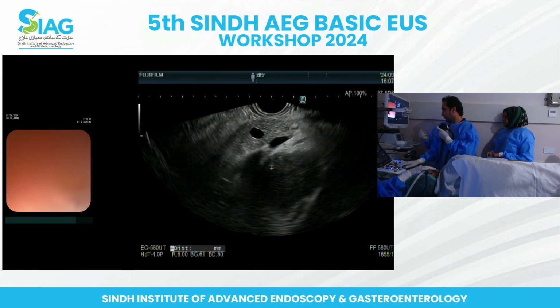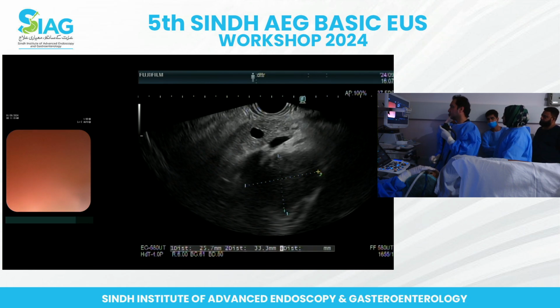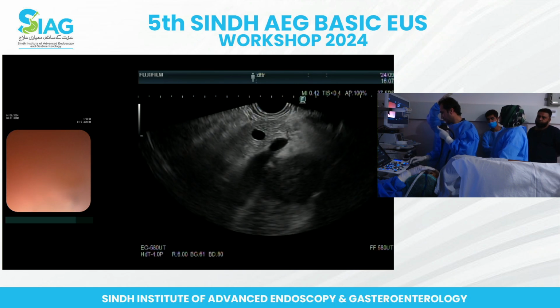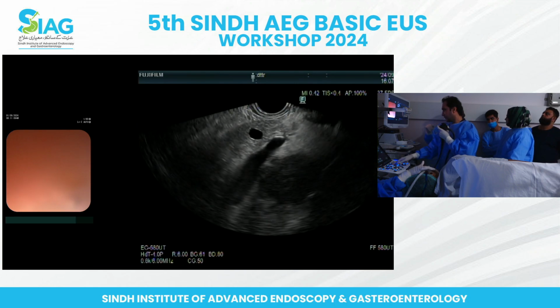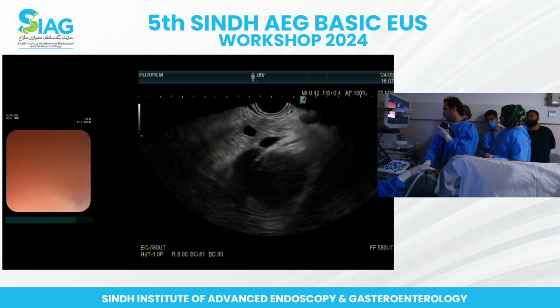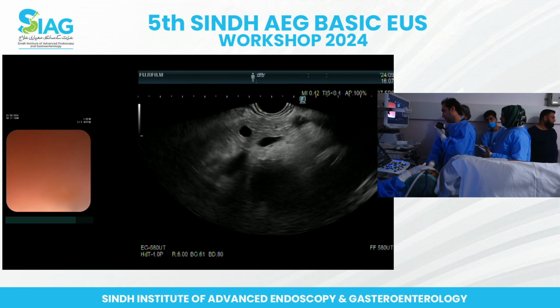Good. So, yeah, this is not a retroperitoneal mass. So, GOJ, 70% of the examination you really should be able to do from station 1 GOJ. And what Junaid has just shown us elegantly here, sitting at the GOJ, is that the portal vein is the divider. The top is the genu and the body of the pancreas, neck, and below is the head. And this is the mass in the head of the pancreas. I don't think this is a retroperitoneal mass. And this will explain why this lady has dilated PD as well as CBD.